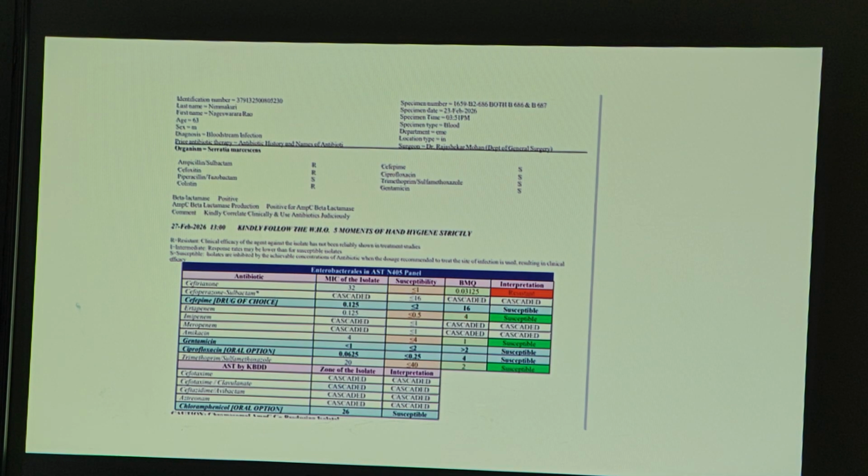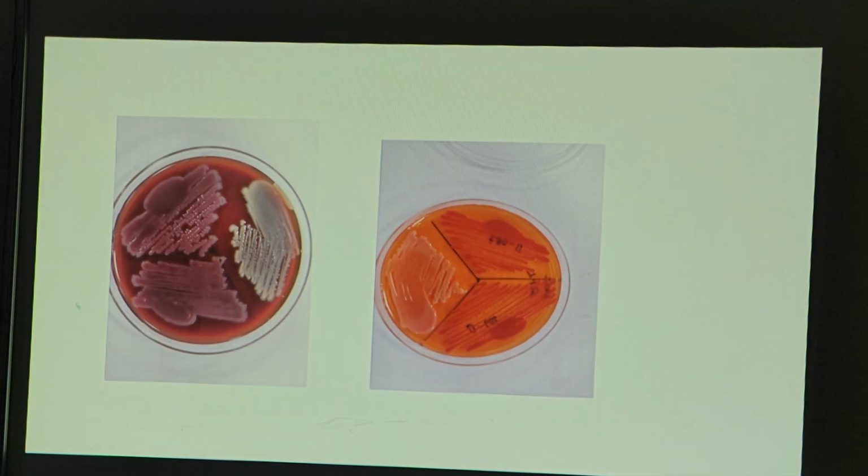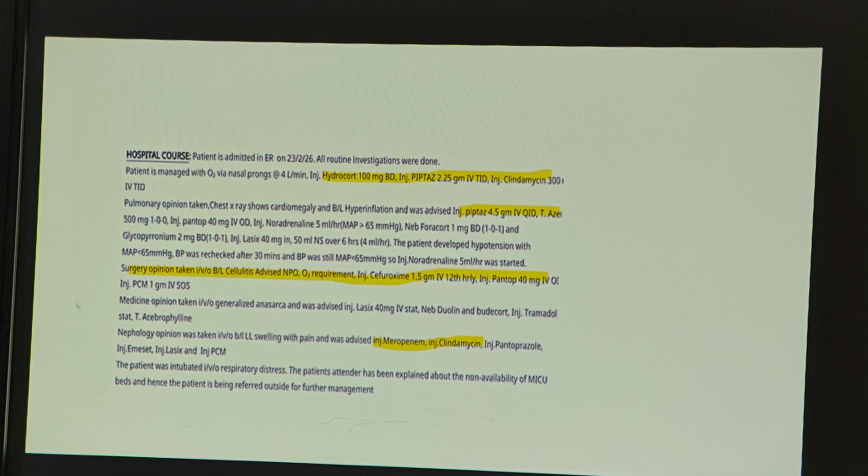We got Serratia. This is the final report of this particular isolate. It is susceptible to piperacillin tazobactam, cotrimoxazole, aminoglycosides, quinolones and all. We particularly mentioned the intrinsic resistance, the SPICE organism, everything regarding Serratia. So in this case, what happened is, after taking proper history, they have taken everything. They looked at the CBC, RFT and all, but different opinions because they are not correlating with each and every one of these consultations.